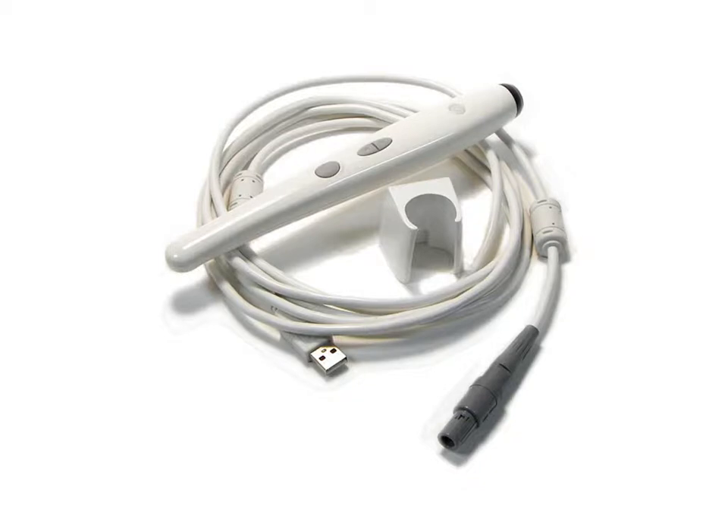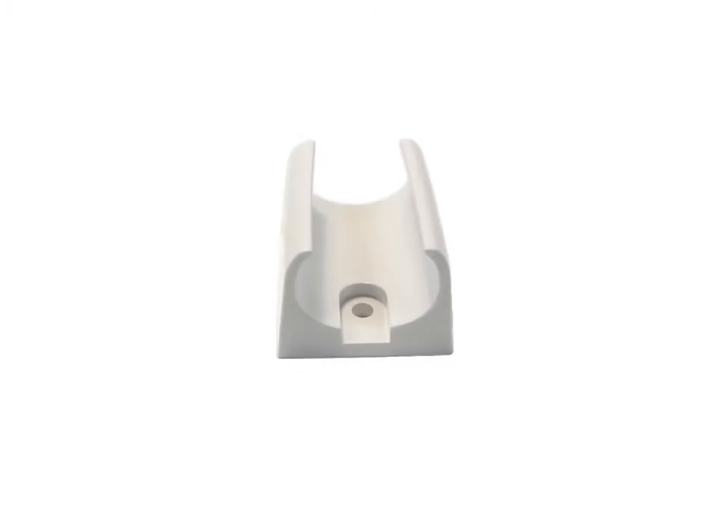Each system ships with a camera, a camera holder, sheaths, and a USB cable. The camera holder should be used to store the camera safely when it is not in use. The camera sheaths are used to prevent the spread of pathogens.